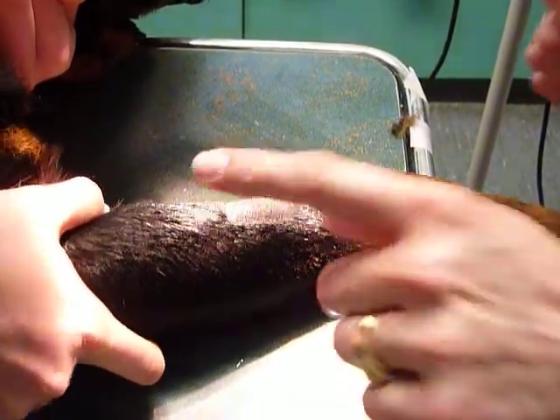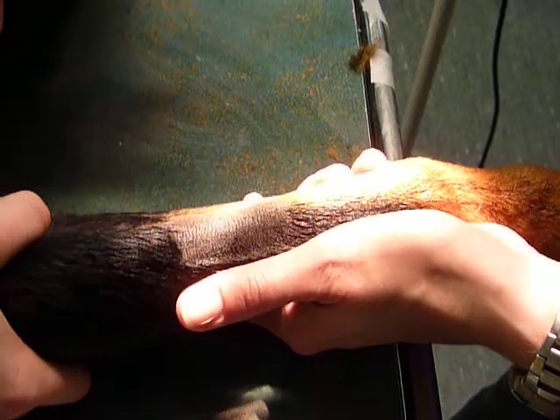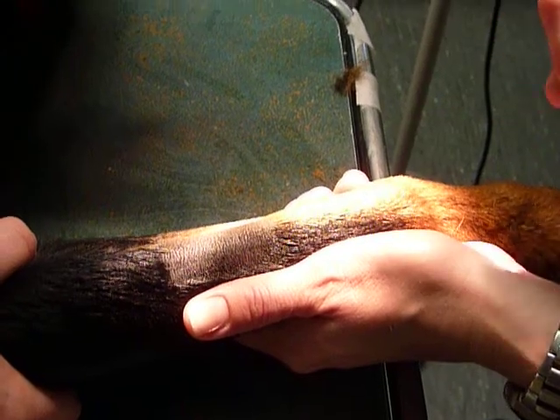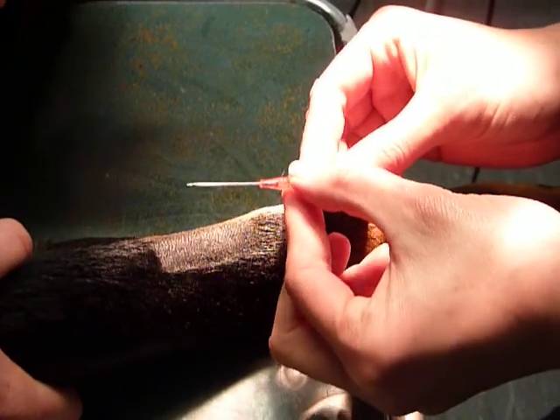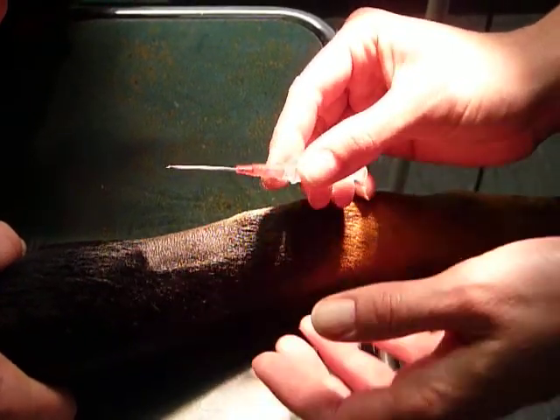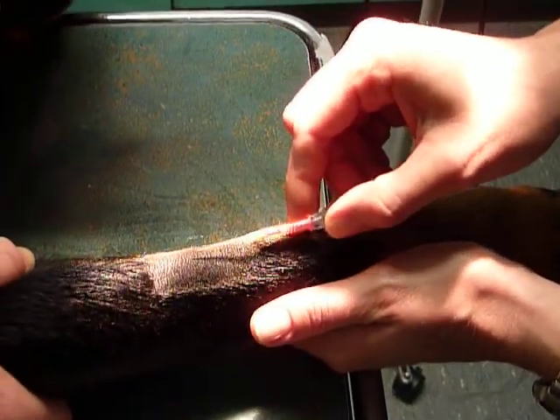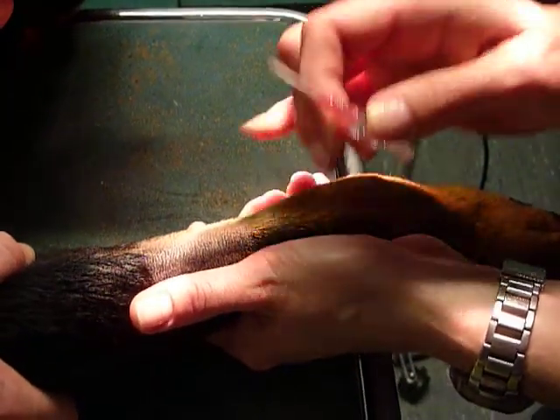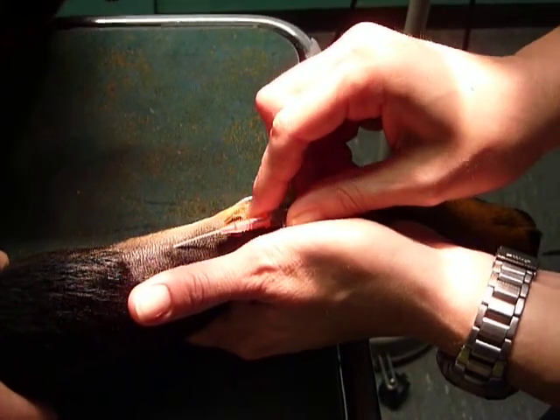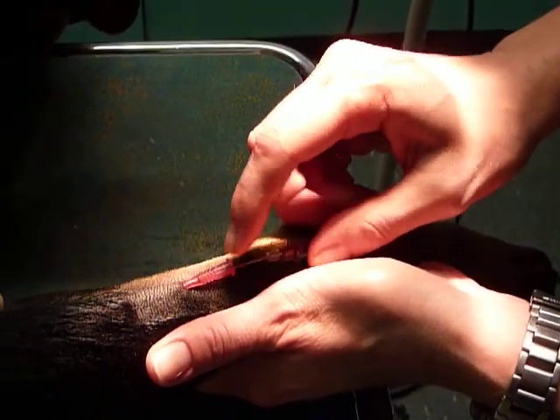Your veterinary nurse has the cephalic vein raised and you should see elevation of the vein through your clip site. With your catheter, slide the pink part of the catheter off the stylet. Bring it back to ensure it is loose so that when you slide it up the vein it will slide easily. Hold up the side to use your thumb as a base guide for your vein into the vein. Check that you have flashback, and once you have flashback, advance the catheter into the vein.